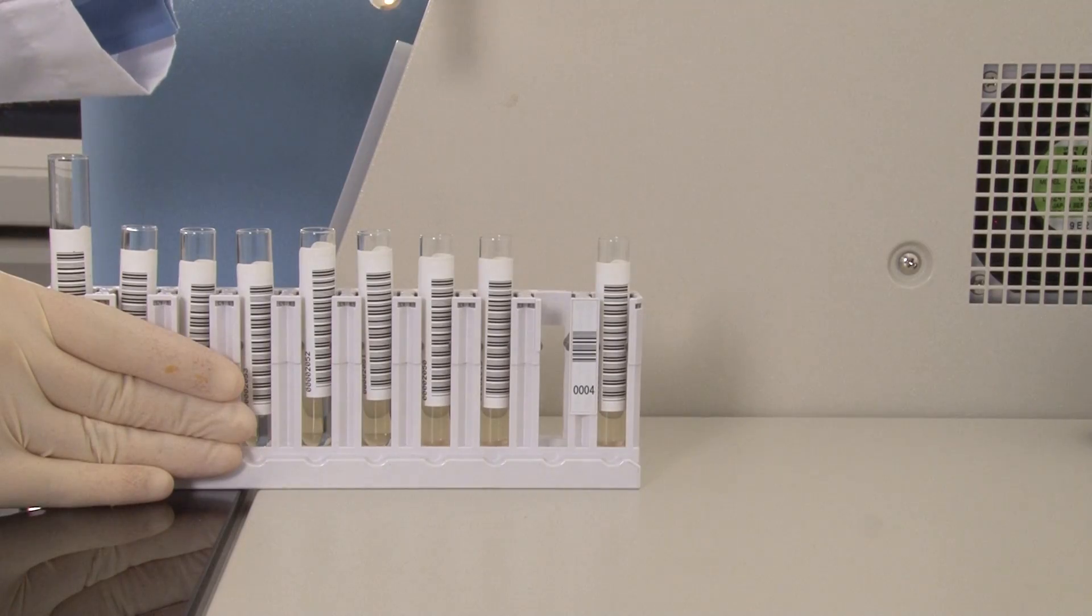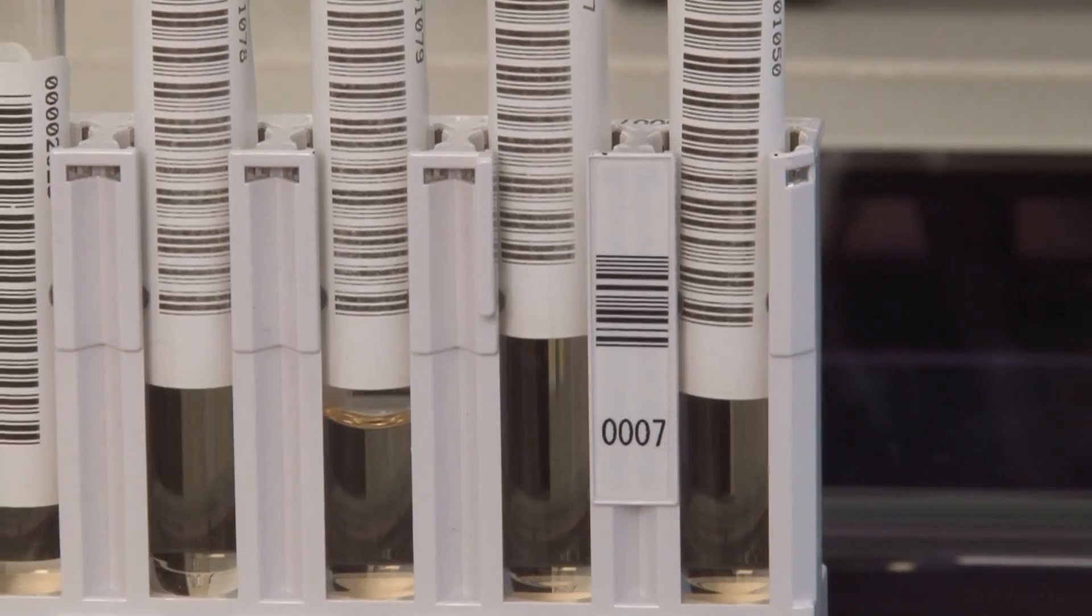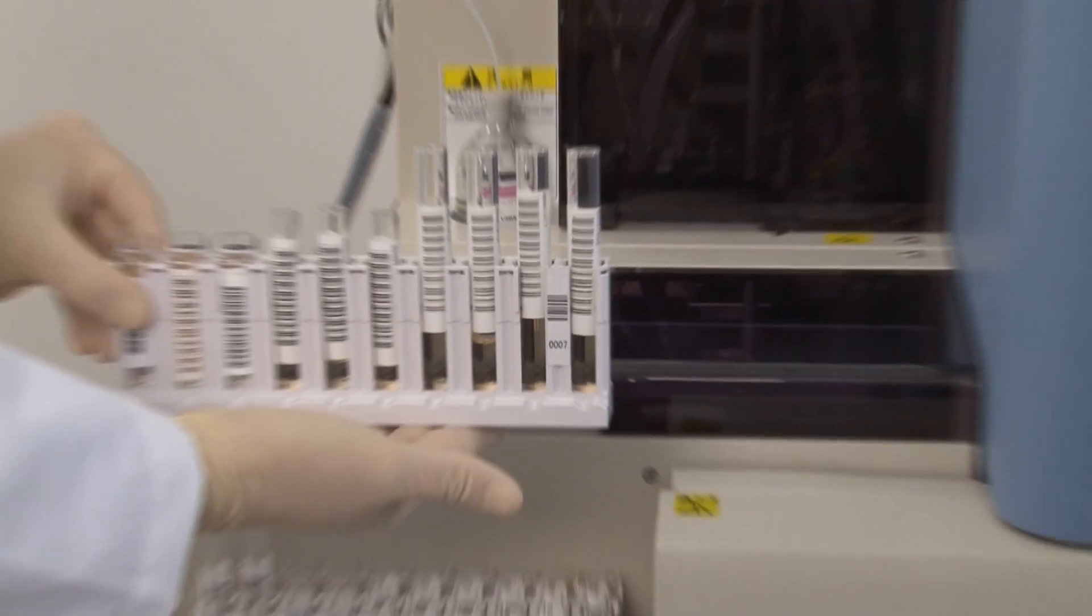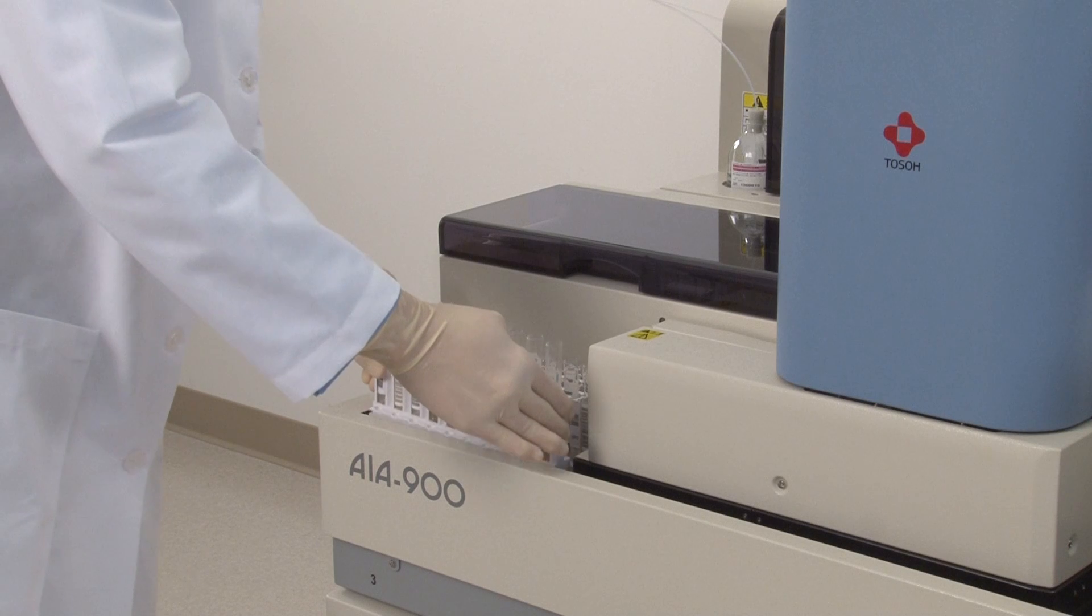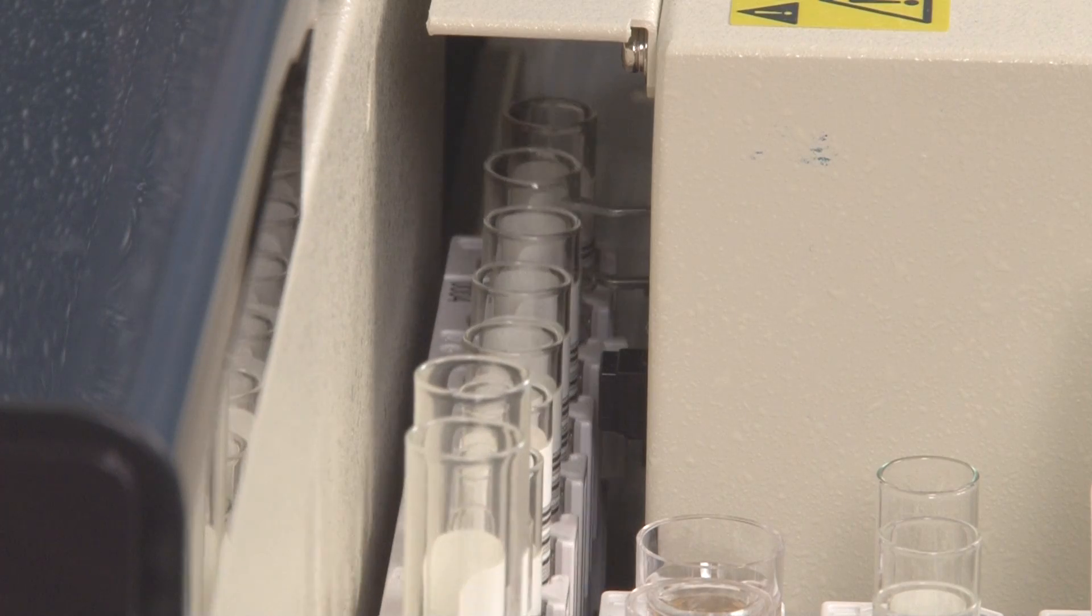To begin testing, the operator simply places barcoded primary sample tubes or sample cups into the barcoded sample racks. If the system is interfaced, the barcoded racks and tubes are read and the requested assays are performed.